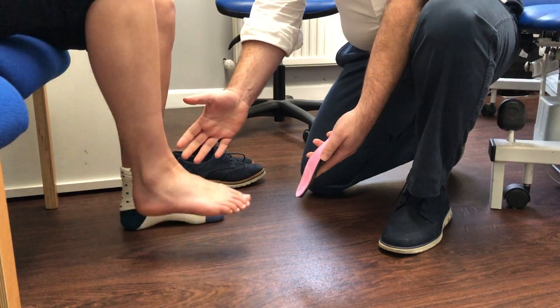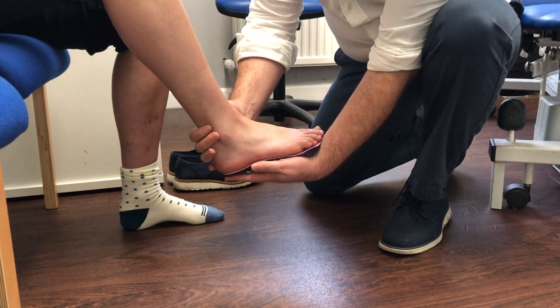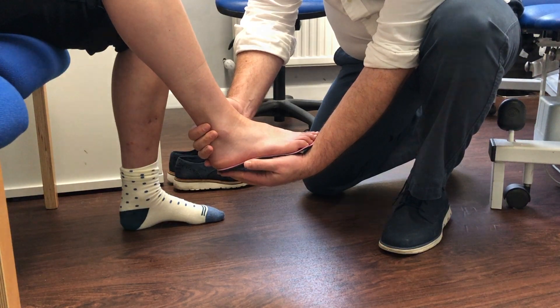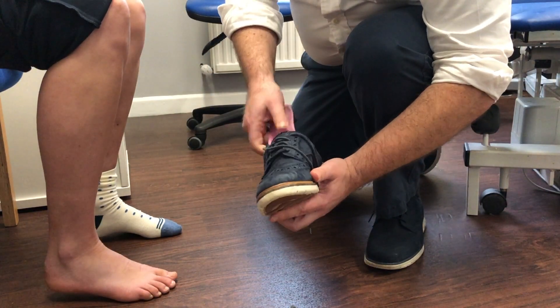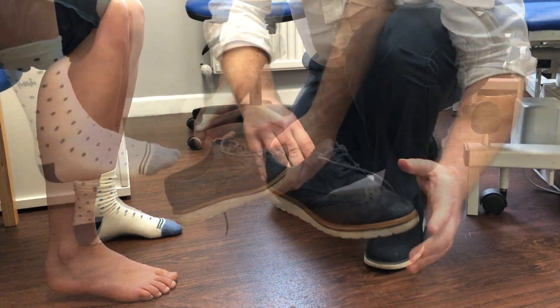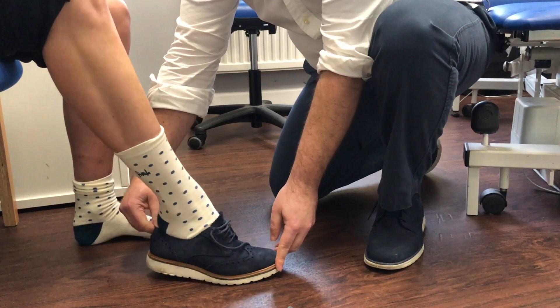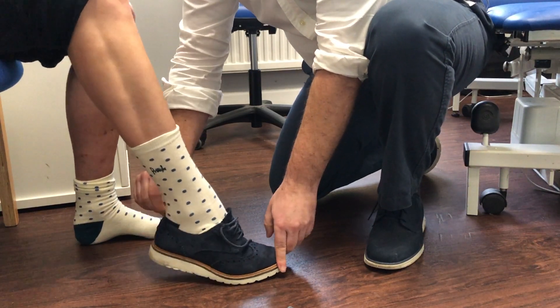The final important step is to fit your orthotics for you. This is key to ensure everything is as we expect and that it feels comfortable for you. All of our 3D printed orthotics come with a lifetime guarantee against the shell fracturing or breaking. Please get in touch if you would like any more information about our 3D printed orthotics.